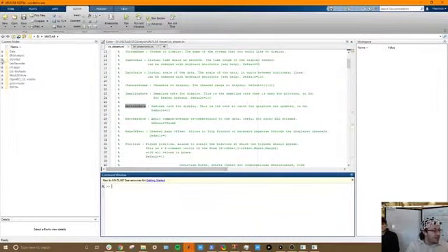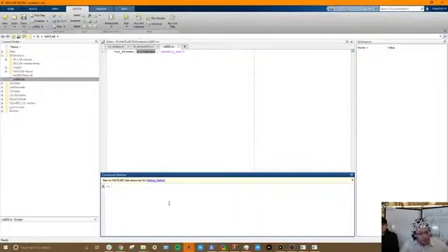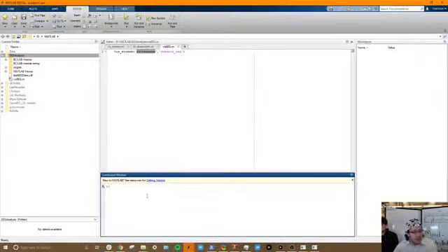I've actually written a kind of shortcut for this. I called it VizEEG, and really all it does is run VizStream with specific parameters. You see it's looking for OpenBCI EEG. That's the LSL stream's name, so you see stream name. So if I run VizEEG and I add to path this, if it loads, there's a lot in here. And I run VizEEG.